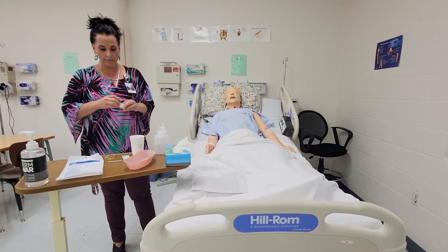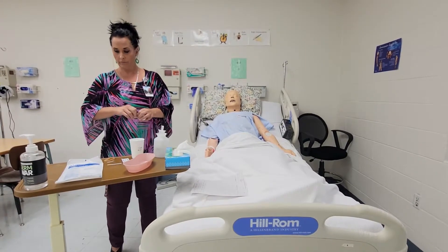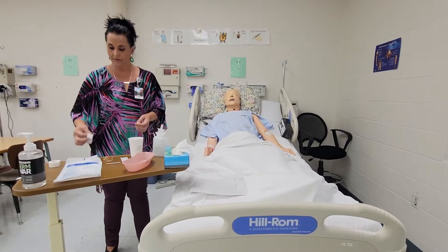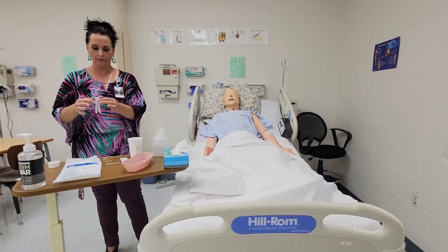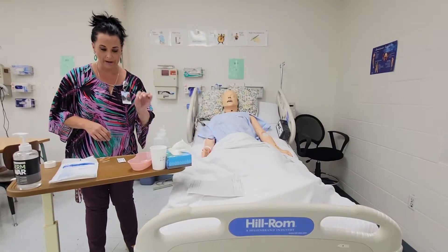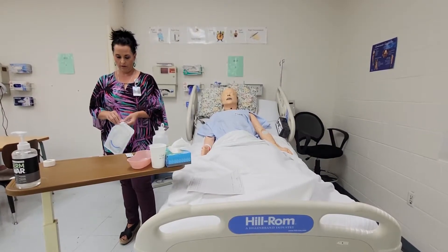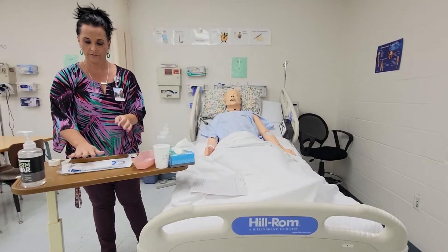First thing I'm going to do is take my tape. Remember, this is not a sterile procedure. I'll cut a longer piece and a small short one. With the long one, you take it and rip it in the center — we call these the blue jeans. Make yourself some blue jeans and place that on the side. I've got my tissue, my cup, my basin. I'll put my pH paper in the basin, got my lubrication jelly ready, and I'll open my NGT bag.